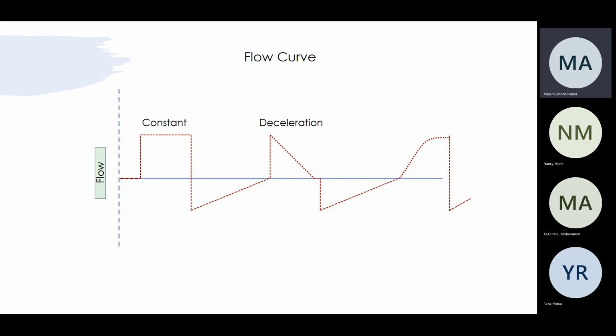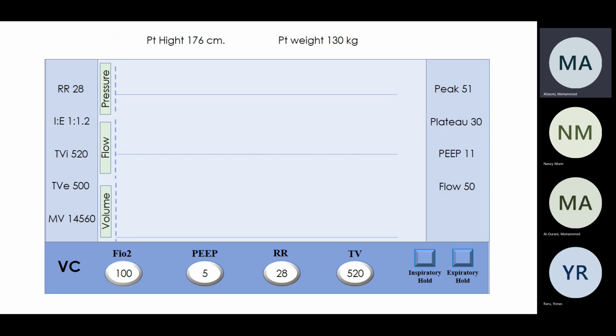But for patient comfort, usually deceleration is the way the patient is more comfortable, because it goes like a normal physiological one. So that's our patient. I'm done in 1 minute, guys. Sorry.